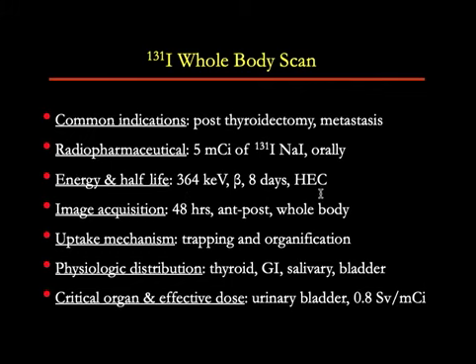The mechanism of uptake is the same as I-123, trapping and organification of iodine. Physiologic distribution is the same as well, with uptake in thyroid tissue, gastrointestinal tract, salivary glands, and some excretion in the urinary bladder.